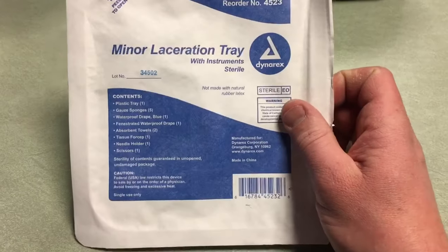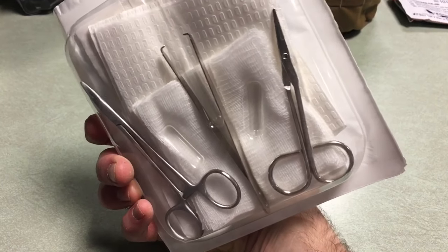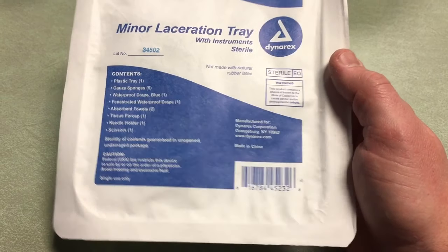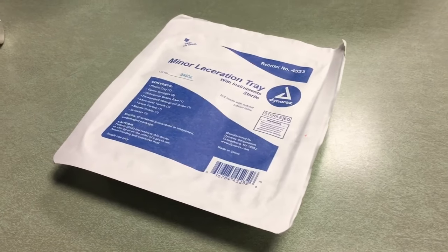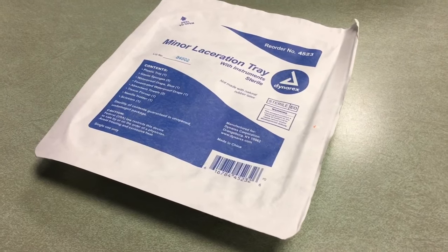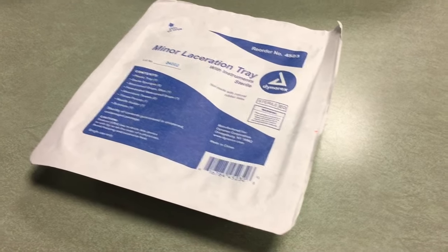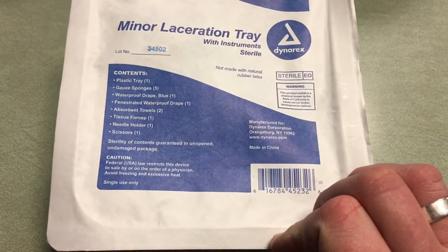At this point we're moving beyond my pay grade. This is the minor laceration tray — to take care of somebody who's got a minor laceration. I'm not in a place where I want to be stitching anybody up anytime soon unless it's a very serious situation and no one else is around. But I always say it's good to have something like this — if you're at an accident scene and a doctor or EMT pulls over but didn't have the gear, you could say 'hey, I've got this stuff, what do you need?'